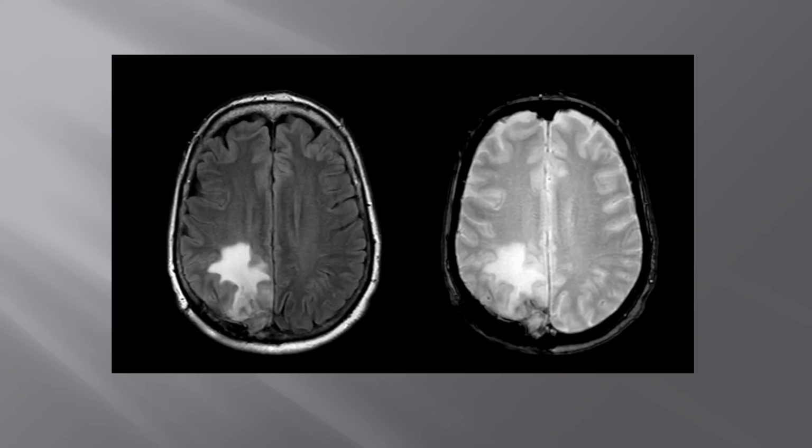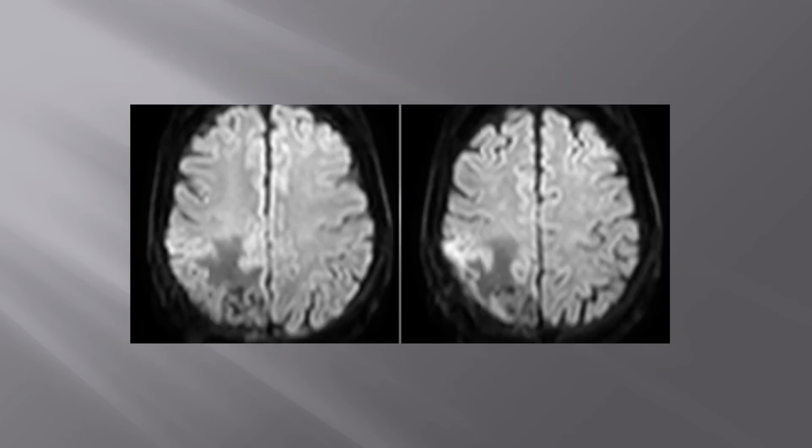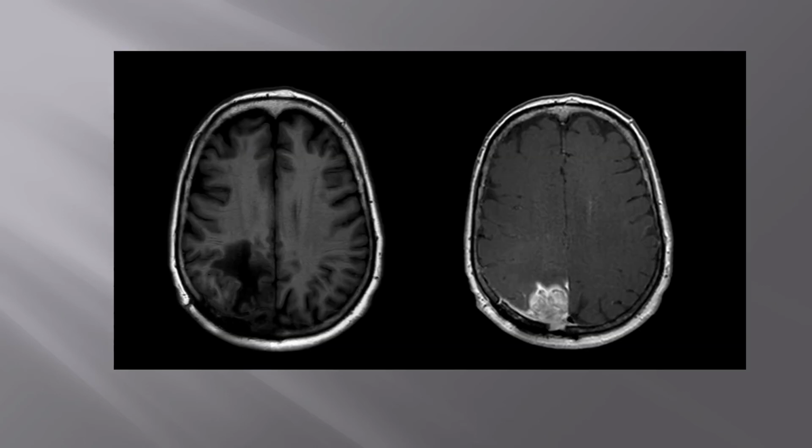It's in the parietal lobe, a mixture, heterogeneous appearance. This looks like vasogenic edema here. Gradient echo has some hypointensity, so probably some blood products. Diffusion, nothing really restricted. And the ISO, certainly not elevated, not quite as dark for the most part as the surrounding vasogenic edema. To really analyze that, you'd want to look at the ADC maps.